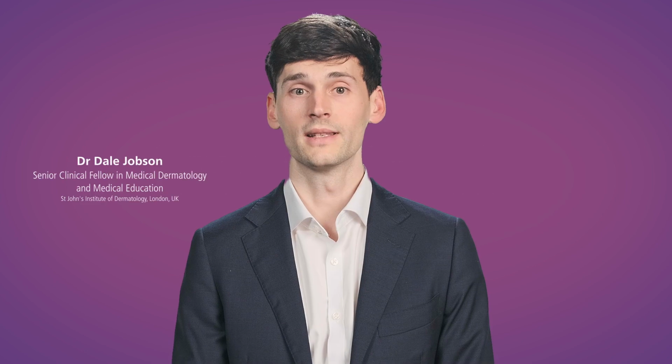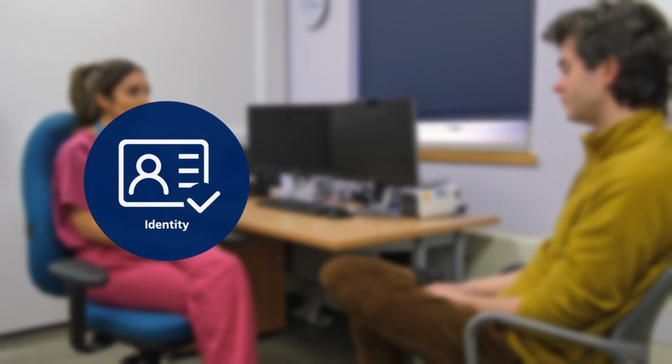We hope you enjoy the St John's Derm Academy Dermatology educational video on how to inject local anaesthetic intended for healthcare professionals. Before starting, confirm patient identity and consent.